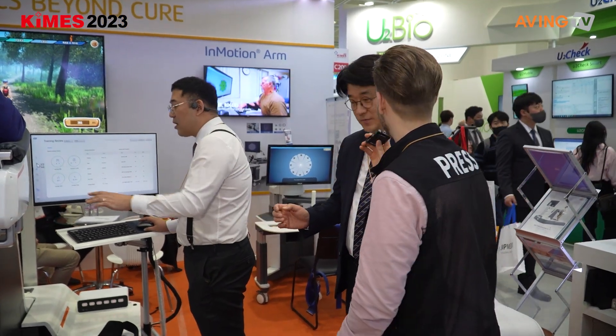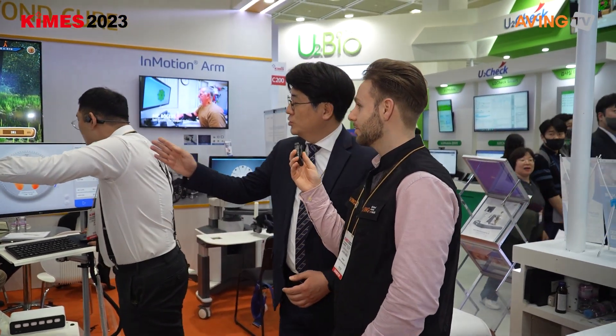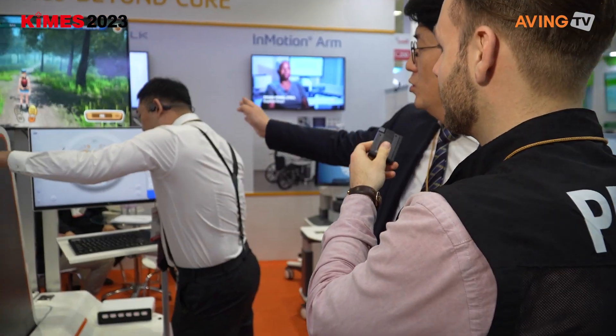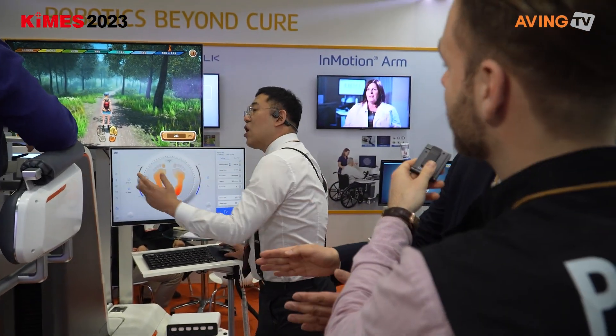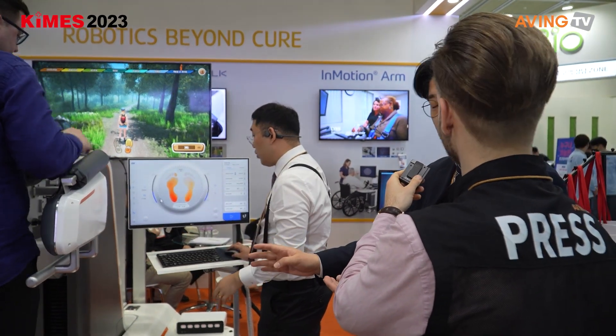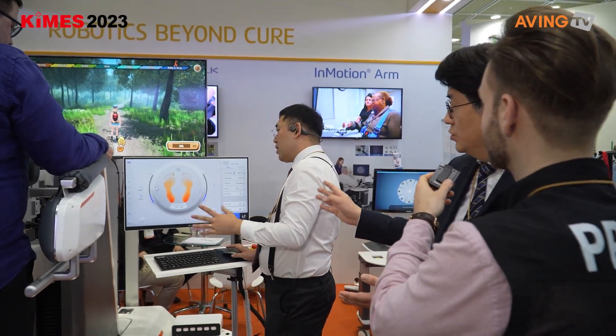As you can see here, this is the screen — the screen is used for controlling the settings. On the right, you can see all the parameters like the height and the speed, etc. You can set it up step by step.